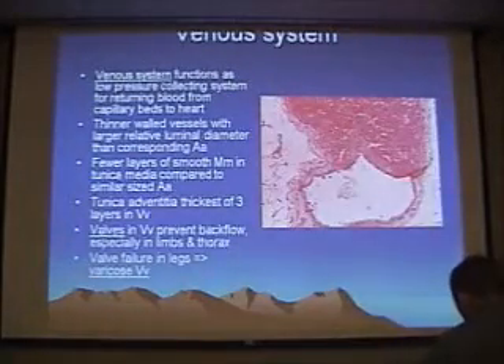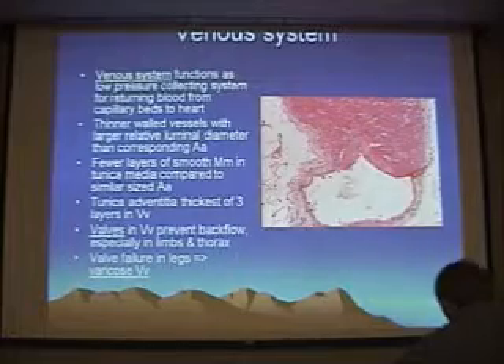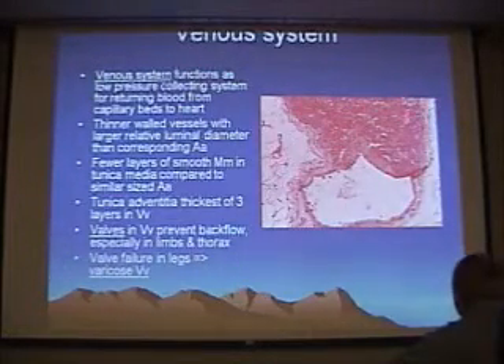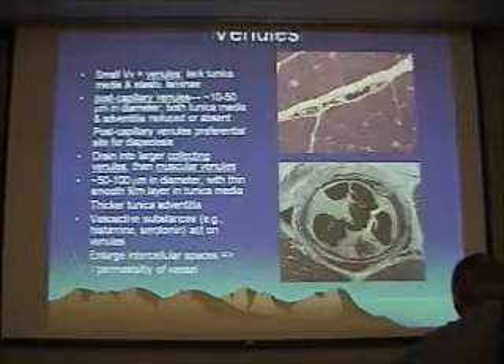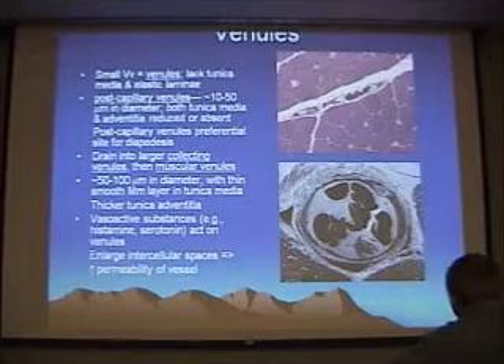One key characteristic of veins — on the venous side of vasculature in general — is that they have valves. Here you can see a valve in a small vein blocking blood flow. And here, as promised, is that same slide again on the venule side.